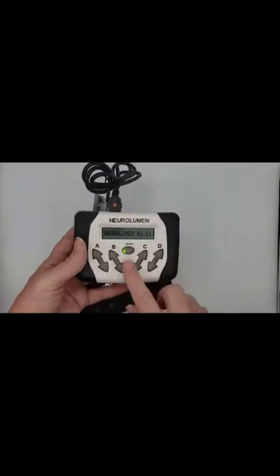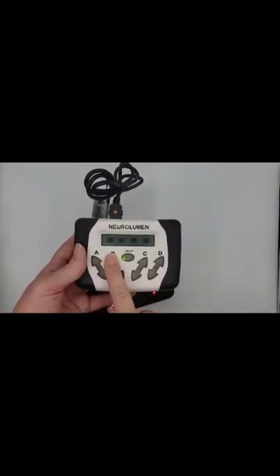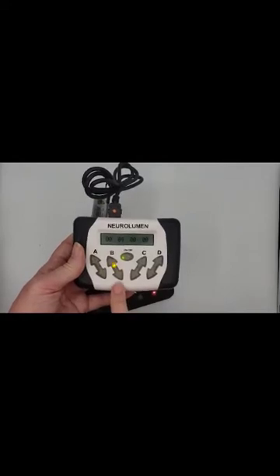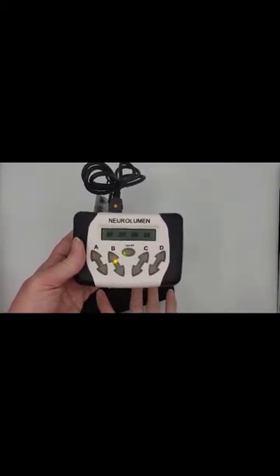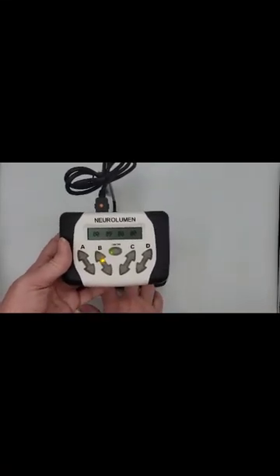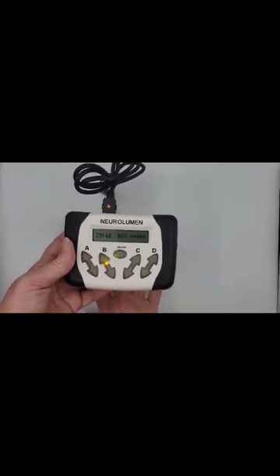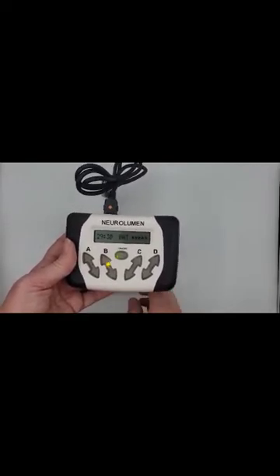You'll place your treatment pads directly on your skin, plug in your treatment pads into your unit, and turn it on. The lights and lasers will automatically turn on, and you can use the arrows to increase your electrical stim. It'll range from 0 to 99. You also notice lights on your arrows. If the arrow is blinking, that just means the gel pad does not have the best connection to the skin. So try to replace your gel pad so that the arrow is solid.